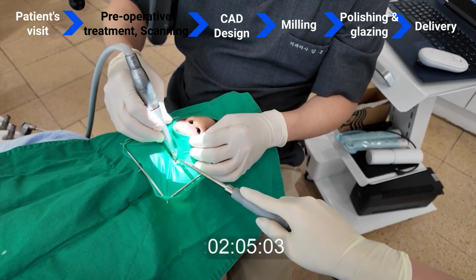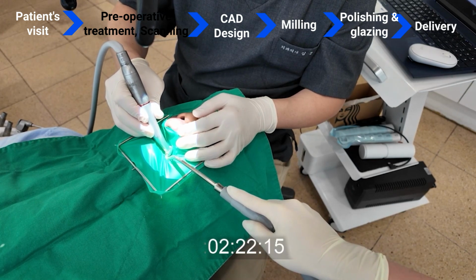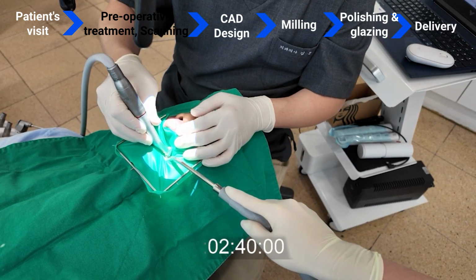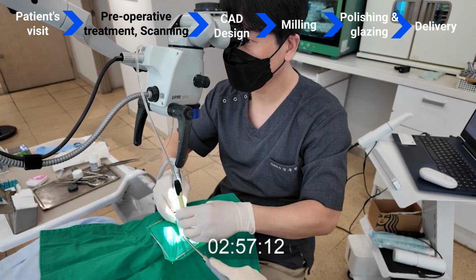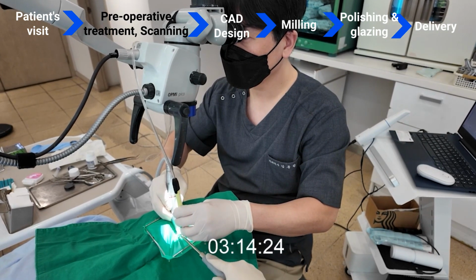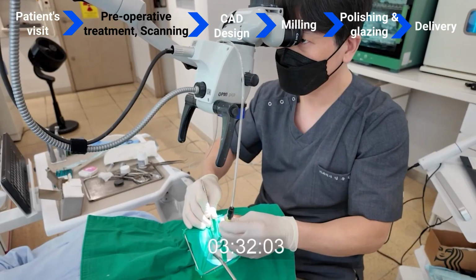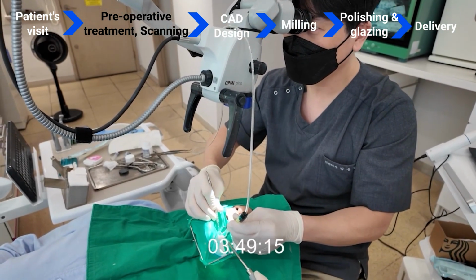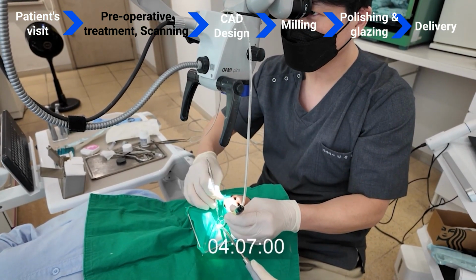All right, it's time to get down to business. We place a rubber dam to isolate the tooth, then carefully remove the old amalgam filling. Using a spoon excavator, we scrape away any remaining decay.